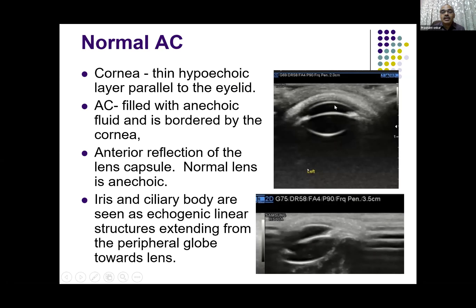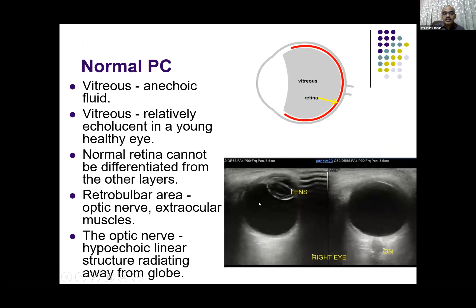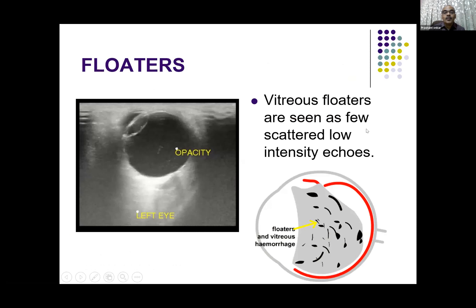The iris and ciliary body are bright echogenic. The lens is anechoic in the younger age group, and as cataract develops it becomes opaque. The iris and ciliary body extend peripherally from the lens to the periphery of the globe. The normal posterior chamber is filled with vitreous which is anechoic, and the normal retina cannot be differentiated from other layers — it is very snugly attached posteriorly. The optic nerve is a hypoechoic linear structure extending from the globe outward, and muscles can be identified on the side of the optic nerve. Normally, in many patients you see floaters — seen as scattered low-intensity echoes or thin lines — mostly broken, moving freely with eye movement. This should be differentiated from vitreous hemorrhage, which shows more echoes, more uniform, and also shows after-movement.